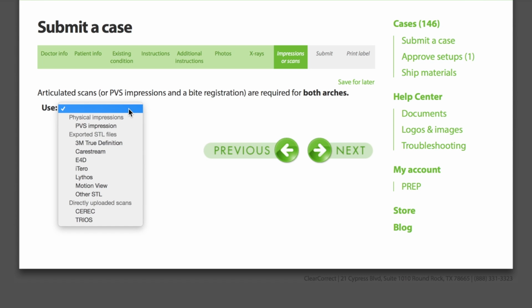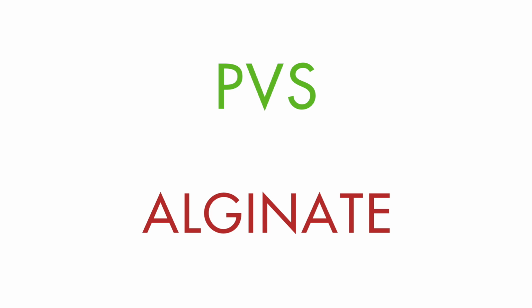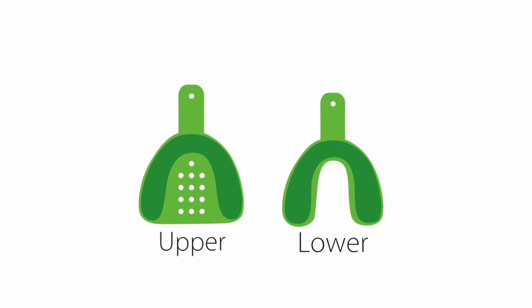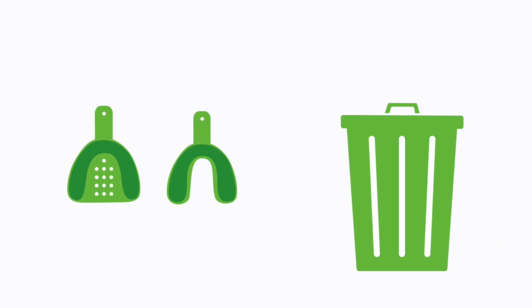In the next section, tell us whether the models will be based on impressions or intraoral scans. If you're submitting impressions, use PVS material. Alginate won't work, and neither will stone models. We need impressions for both arches, even if you're only treating one arch. Use disposable impression trays. Metal trays can't be scanned, and all physical records are disposed of after processing.